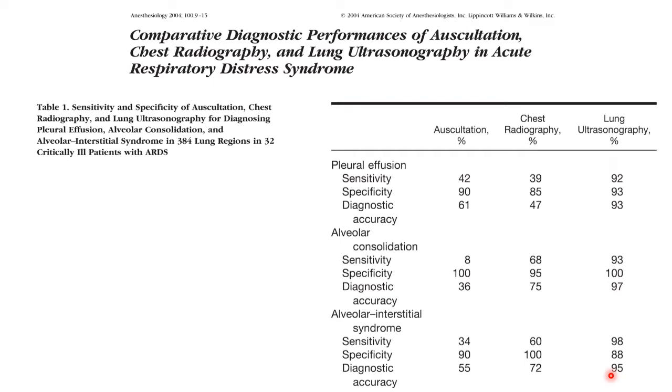This is another study that compared lung ultrasound to chest x-ray and auscultation in critically ill patients. And you can see that the sensitivity, specificity, and diagnostic accuracy of lung ultrasound is much higher than these standard modalities that we typically use.